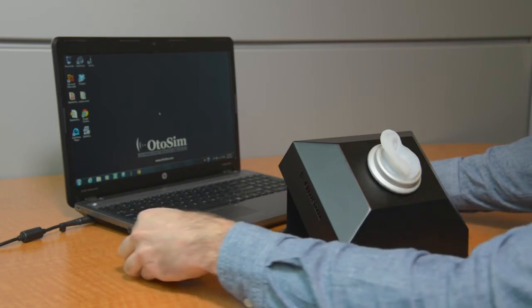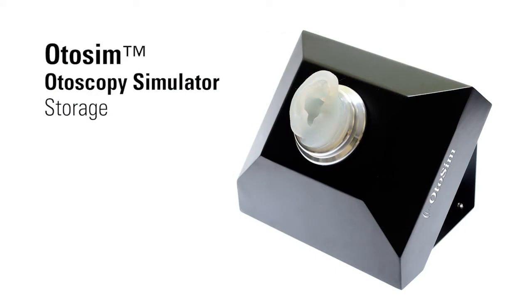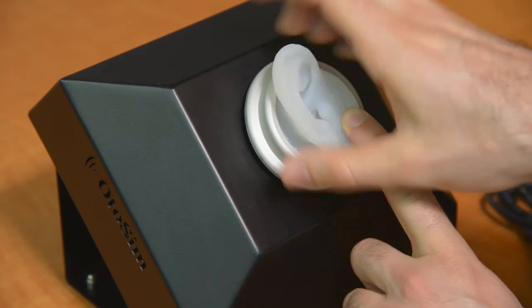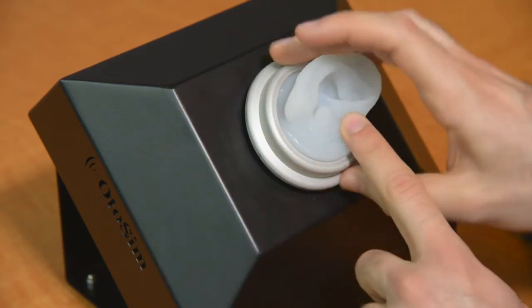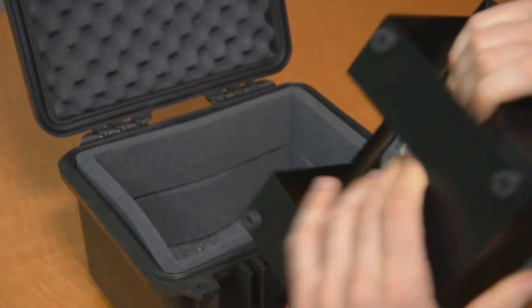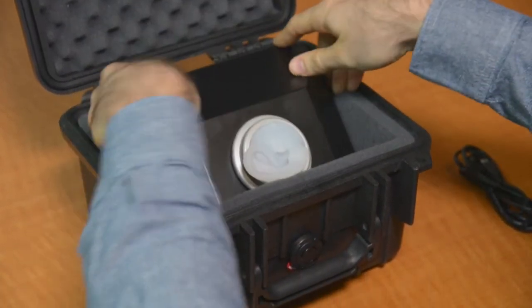Once you are finished using your OdoSIM unit, simply close the software and unplug the unit from the computer. Storing OdoSIM: We recommend that you store the OdoSIM in its protective case when it is not in use. To store away the OdoSIM unit, loosen the retaining ring, rotate the ear 90 degrees clockwise, and re-tighten the ring. Then place the unit back in the Pelican case with the rubber feet touching the back wall of the case and the ear form facing up.